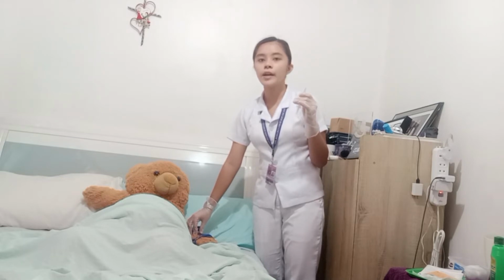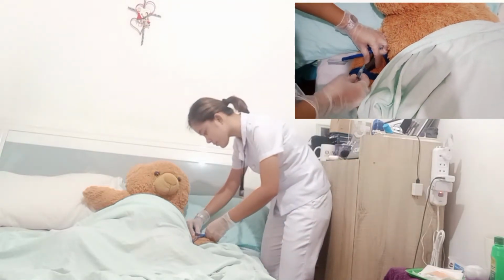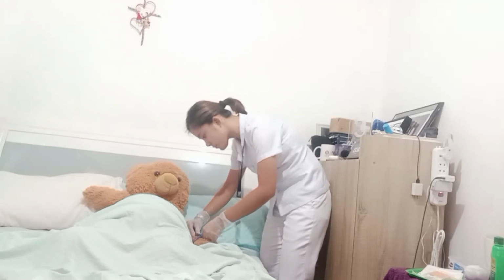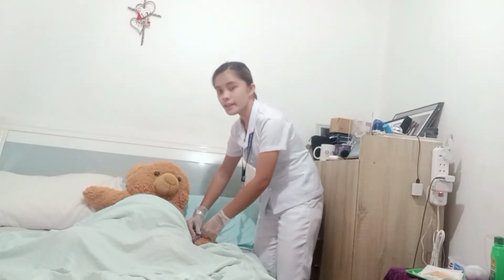So now pull the needle very close to the patient's skin and insert it slowly at a 5 to 15-degree angle until the resistance is stopped. So now advance the needle up to the epidermis about 1/8 inches.